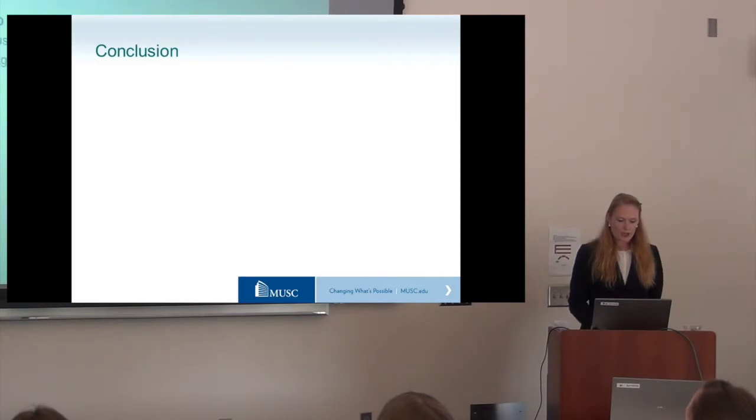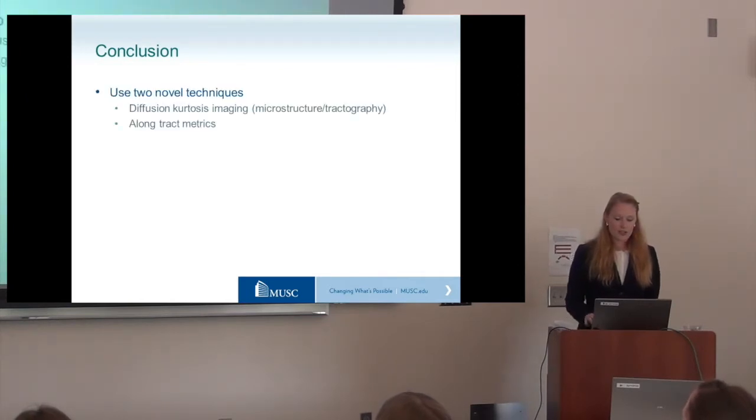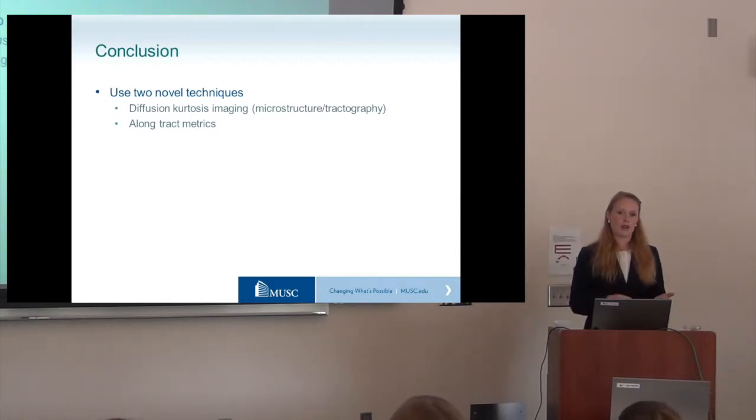So to conclude, we used two novel techniques to perform this work. We were using diffusional kurtosis imaging, both as a measure of microstructure and for improving upon tractography.